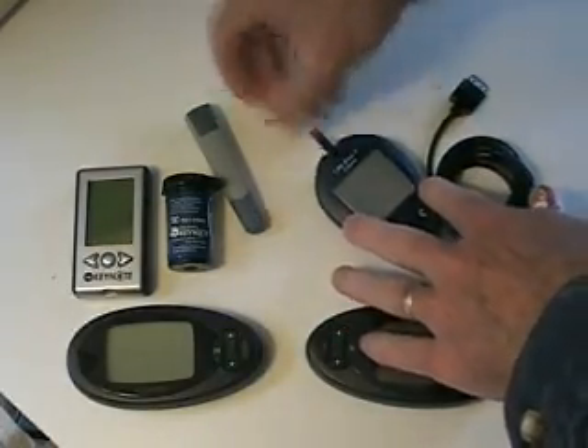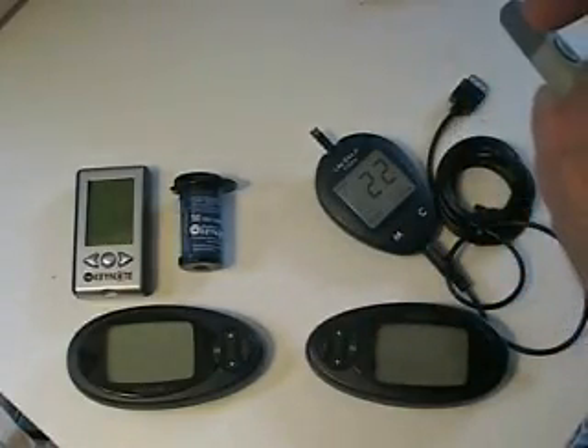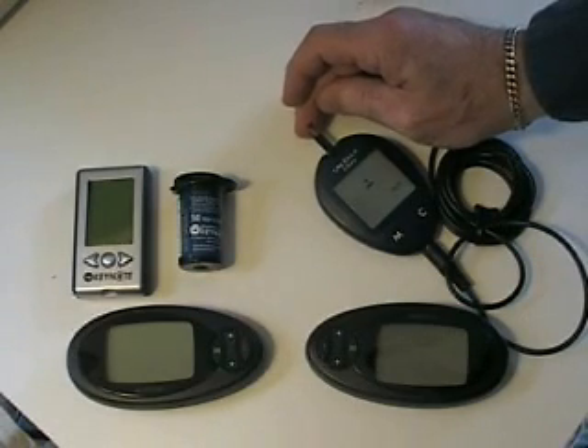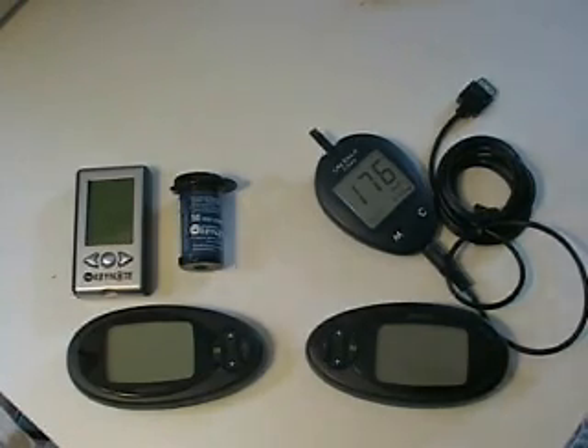I take a blood glucose strip and a slightly large drop of blood. Wait for the countdown. Here we go — 176.